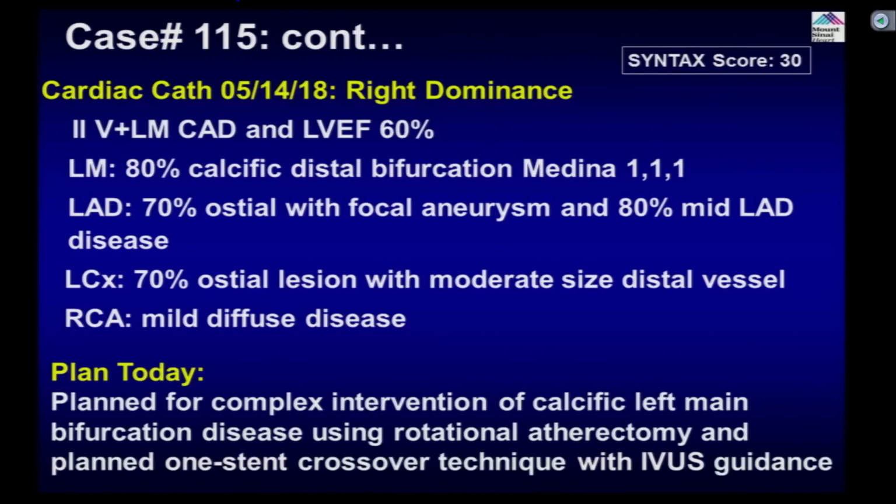One-stent technique because of the fall risk, potential for dual antiplatelet interruption. So single stent is the one we want to do in this particular case. Not necessarily just because the patient is on NOAC. Yeah, and NOACs also you try to avoid. Risk of bleed is very high at this age. If you have triple antithrombotic therapy, you want to stay on one antiplatelet therapy in her.